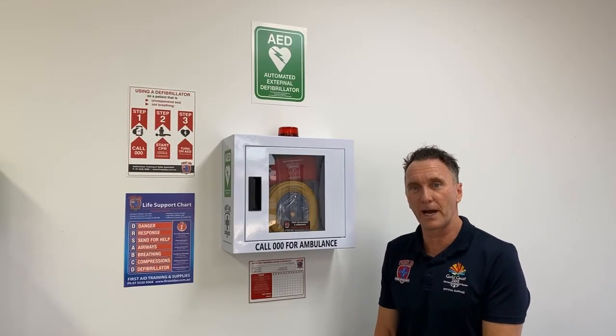Introducing the HeartSign 500p Cabinet Bundle from First Aid, Accident and Emergency — the defibrillator supplier to the Commonwealth Games and Parkrun Australia. Let's have a look and see what's in this particular bundle package.